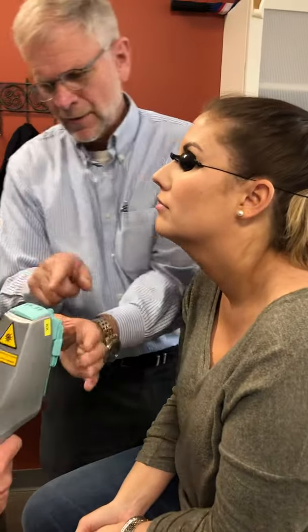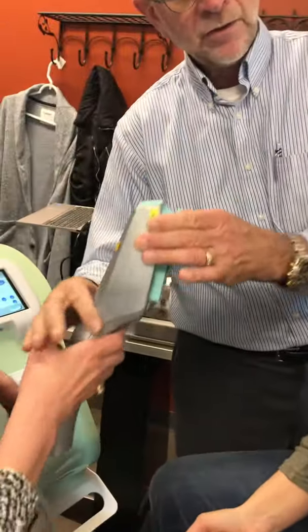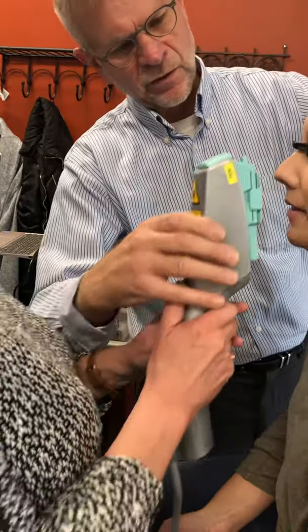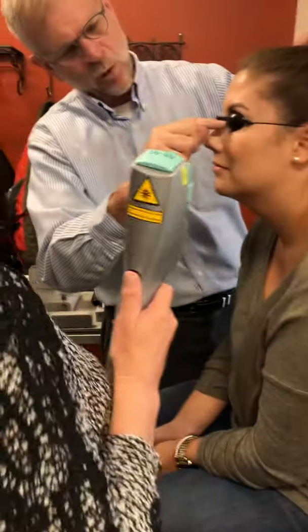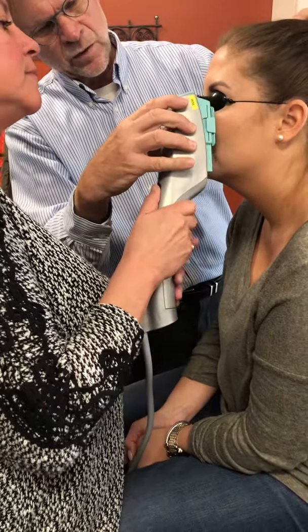Dr. Quintanilla, what I want you to do is you see that you have this little notch. Okay, your first treatment is going to come, let's bring her down. Your first treatment is to bring this notch right there. See the goggle, she's too high for me. Take a halfway point on the goggle, and then the first one is going to be right there.